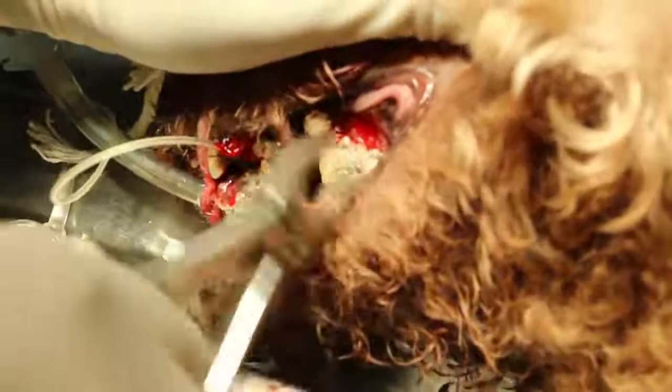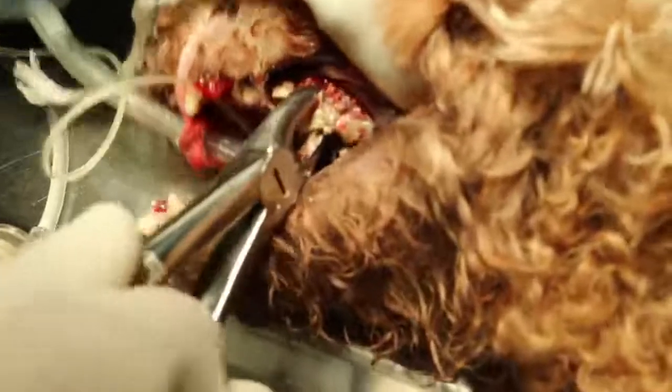Wear the gloves. We'll look at Premolar again. There's a very strong smell of bad breath here. This one is probably very hard tartar and periodontal disease stage 4. This is probably Premolar. This is Molar 1. Premolar 4 should be this one. Crack the tartar, you can see. If it's strong, then we don't extract. It looks strong — just test it then. Okay, it's okay.